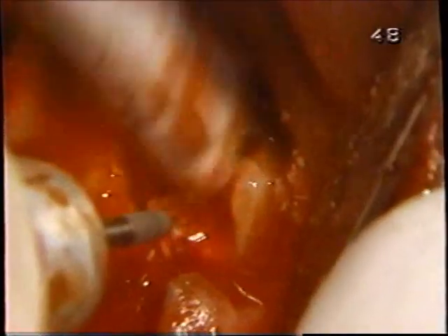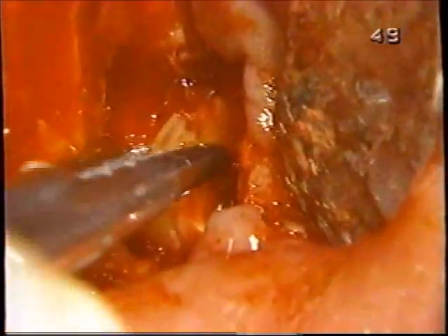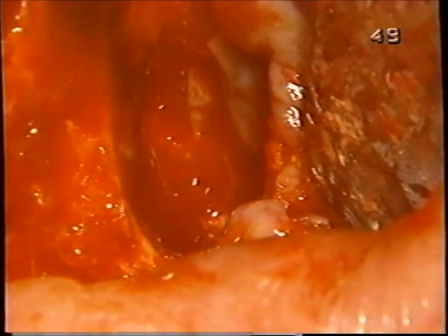Section. Okay. That piece is out. Okay, suction that root. Okay. Put that piece right there.